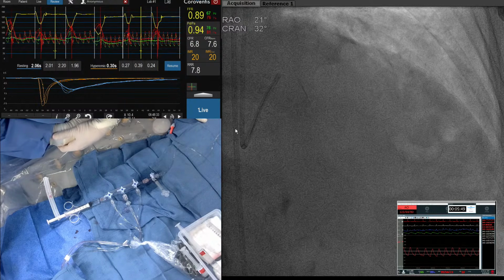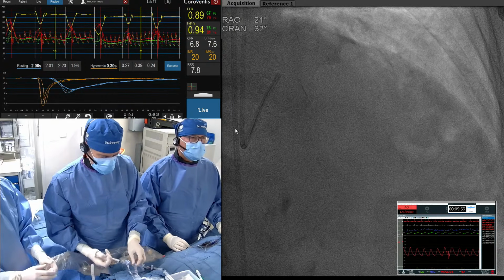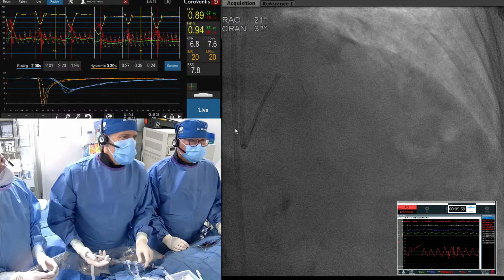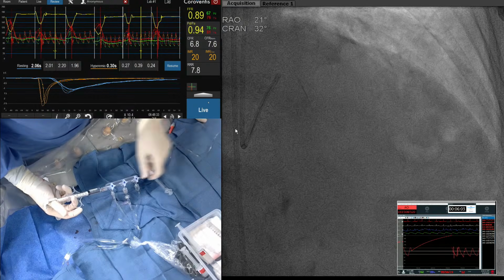Yeah, she had inferior ischemia and was a very symptomatic patient. And then we're going to end up with a question mark here. So I will vote to do it if we have the time. Well, we can do it offline for sure. Offline, yeah. Okay.